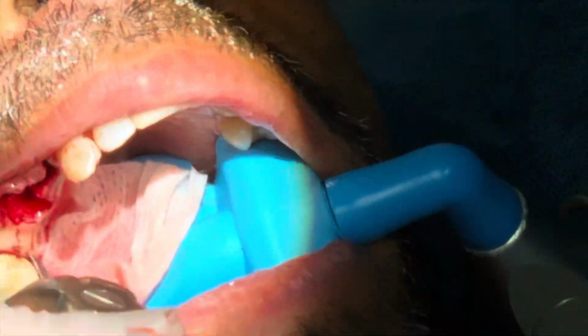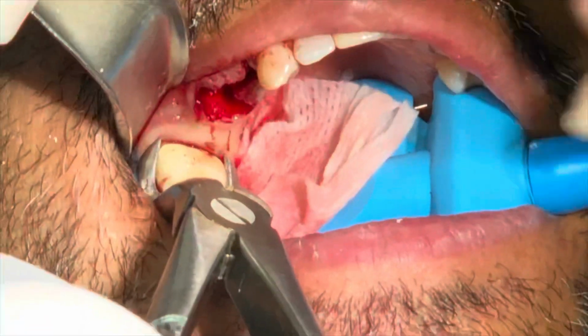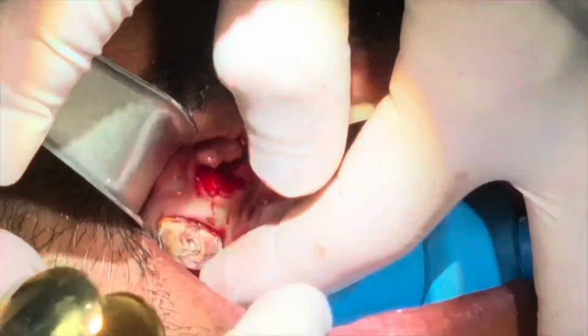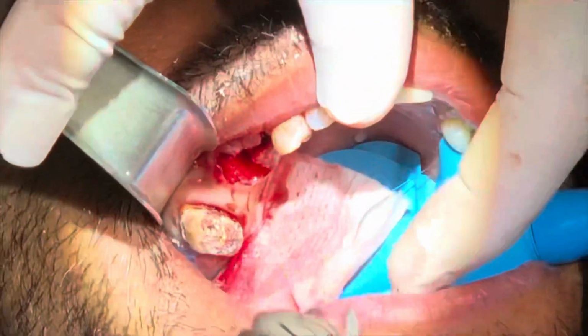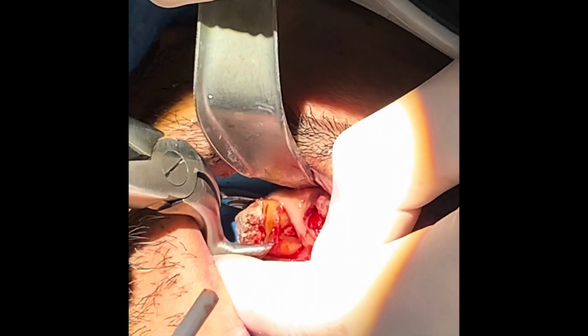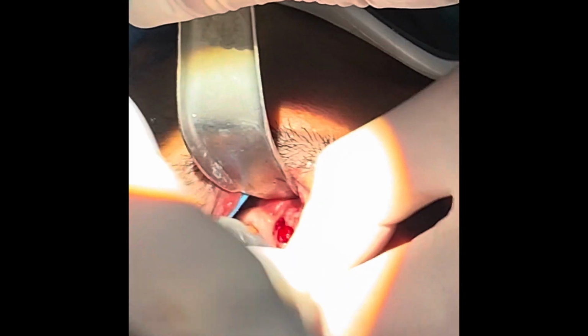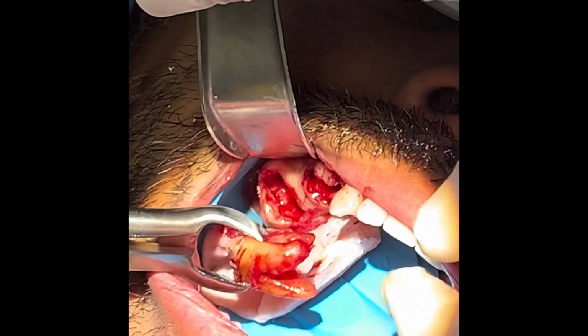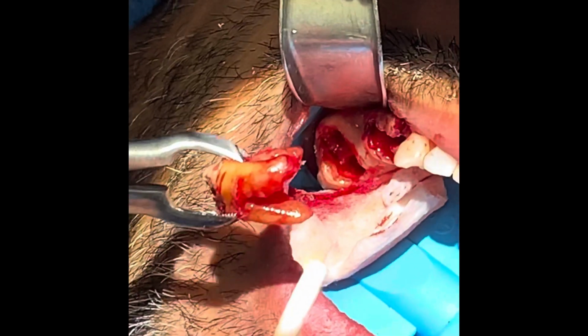We always warn the patient that the crown may pop off, or it may chip, or it may break, so we have to be ready to catch the pieces or to protect the mouth. And what we have here is called a Mr. Thirsty, which has a 3-in-1 function: a bite block, suction, and blocking the throat.